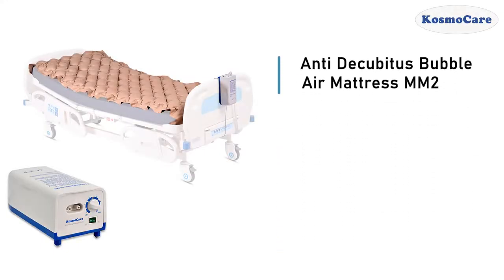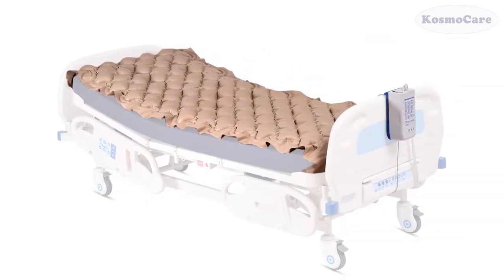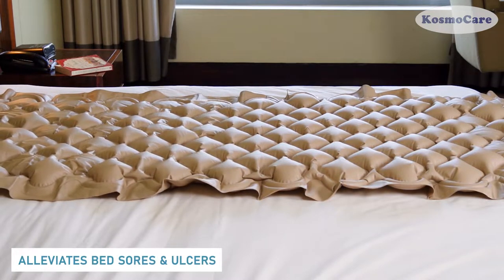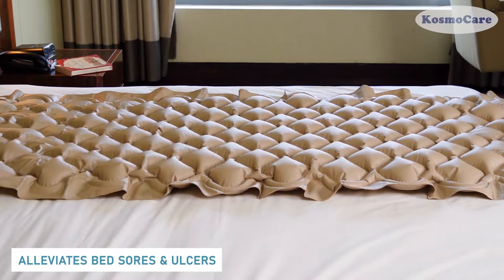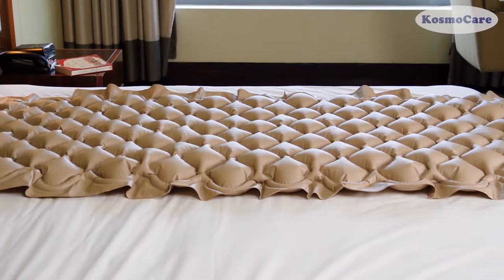The CosmoCare Anti-Decubitus Bubble Air Mattress MM2 provides comfort and relief from bed sores and ulcers. The Bed Assist Rail is great for elderly people, individuals in rehabilitation post-surgery, or those with back pain to get in and out of bed unassisted.